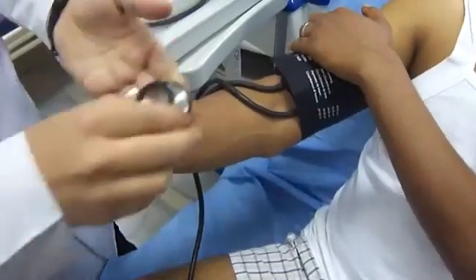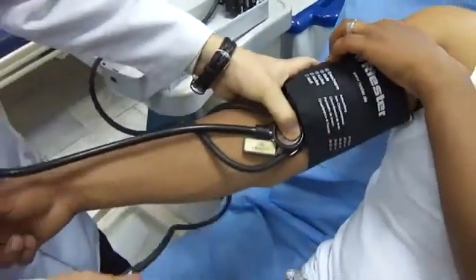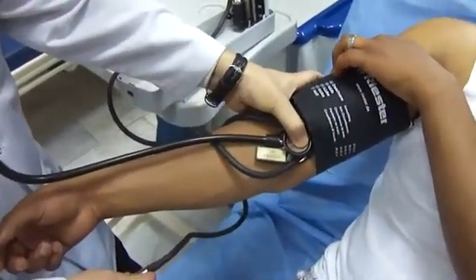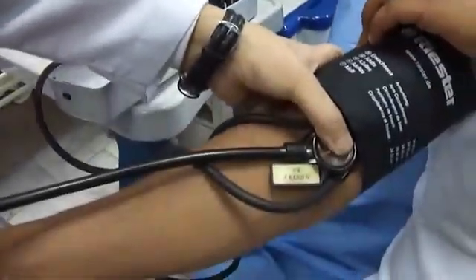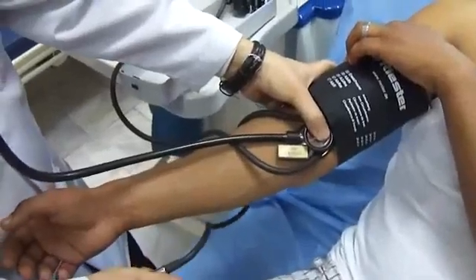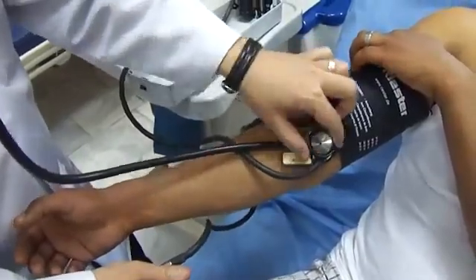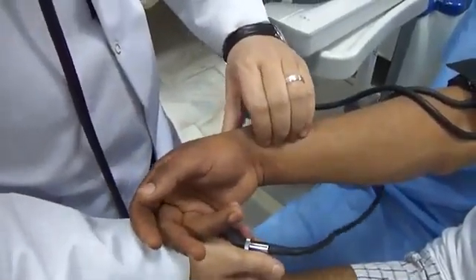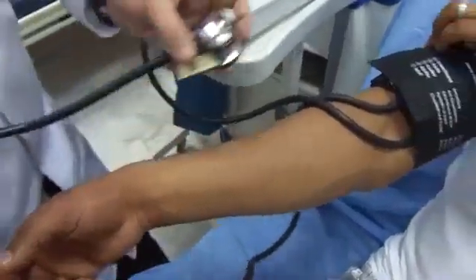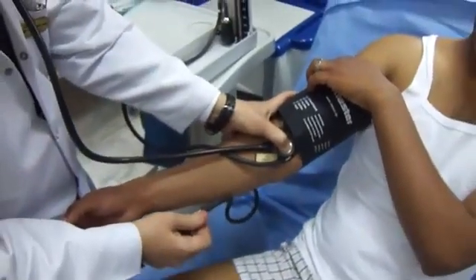I'll slowly deflate by two millimeters of mercury each time until I get the first Korotkoff sound. To ensure this is the first Korotkoff sound and to rule out an auscultatory gap, I'll also check the radial pulse, which should now be palpable. The radial pulse is palpable, so this is definitively the systolic blood pressure.